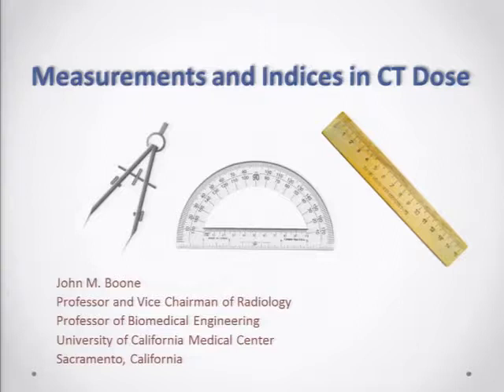To key on your question, what we're asking the vendors to do is to measure H of L in the longest phantom and then also to measure it in the short phantom, to provide sort of a calibration term between those two. That's what you're getting at, I think.